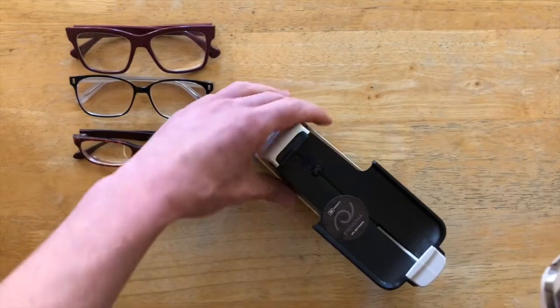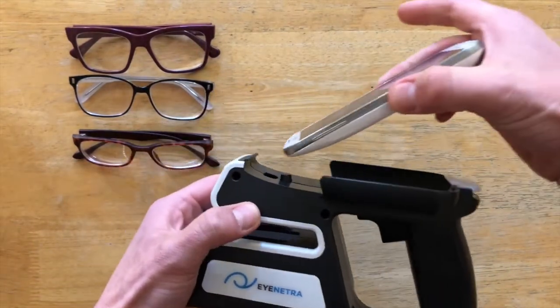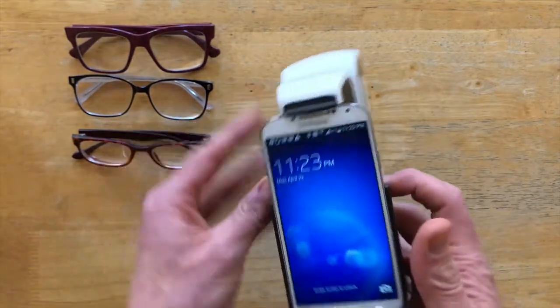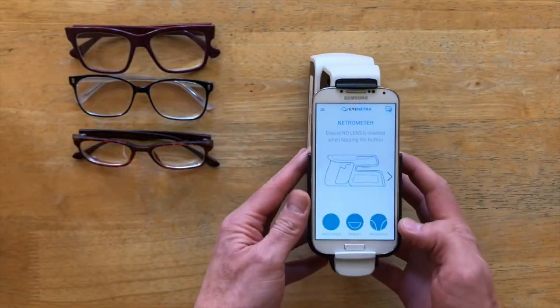First things first, to insert the phone into the Netrometer, I start by inserting the front first and then clipping in the back, and the application should open up automatically.